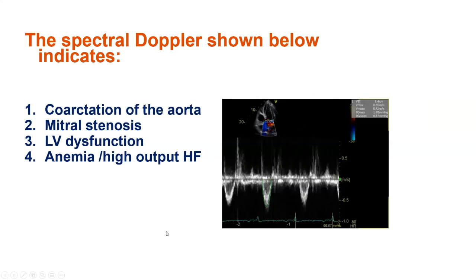Here's a spectral Doppler — what's the diagnosis? We're seeing an alteration in the magnitude of the LVOT VTI. A roughly normal LVOT VTI should be in the high teens to low 20s, dependent on heart rate. What you're seeing is pulsus alternans, which is indicative of severe LV dysfunction.